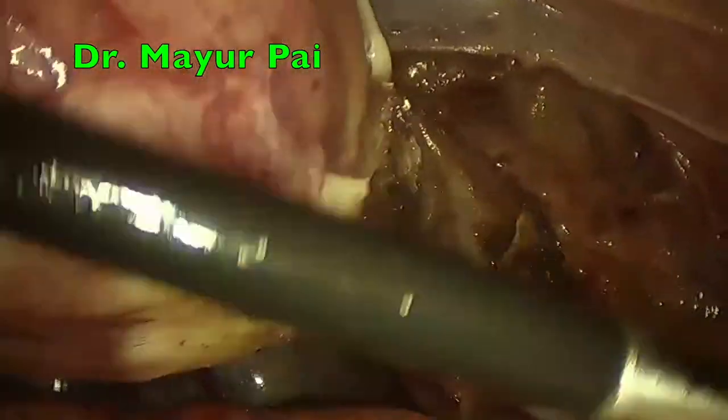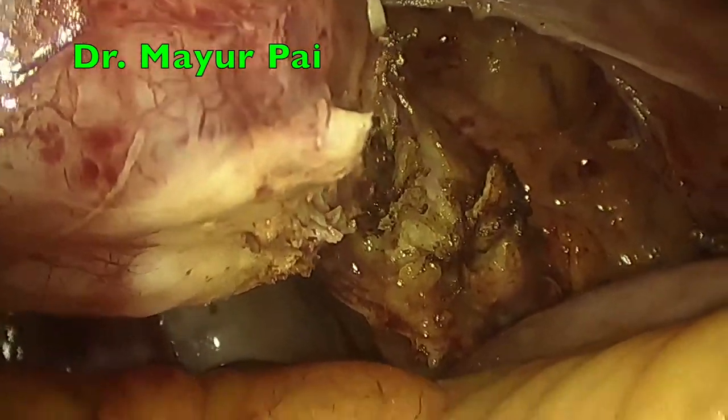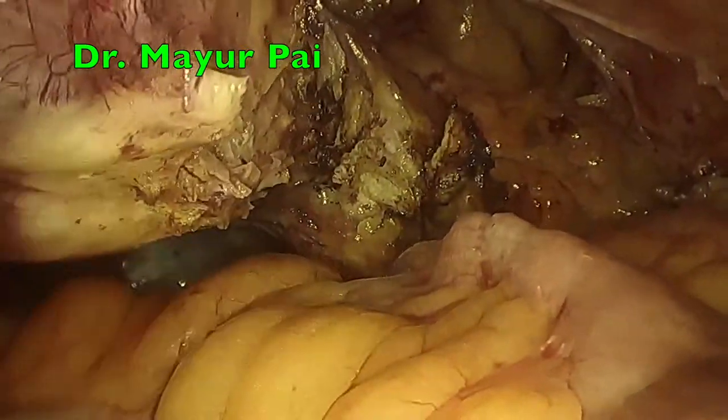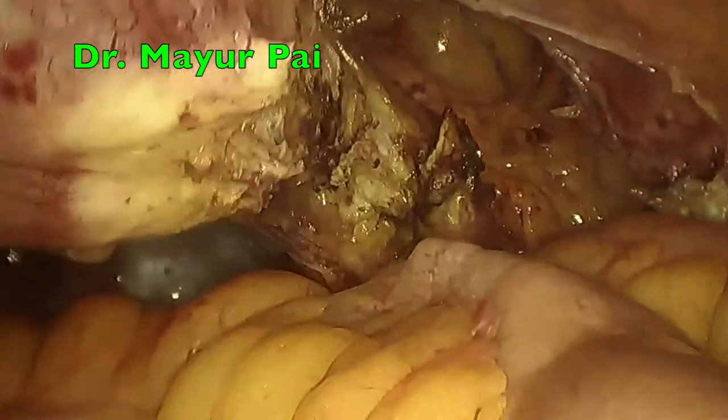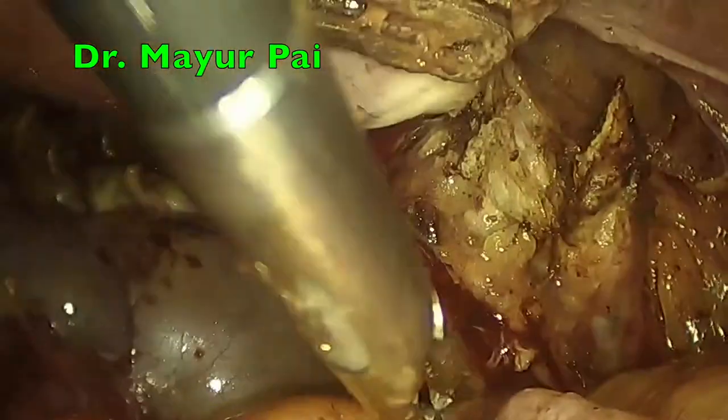However, in case you don't want the field to be spoiled with the backflow blood, you can always give it a quick coagulation. For all practical purposes, the hysterectomy is almost done. Now all that needs to be done is colpotomy, that is opening of the vaginal vault.